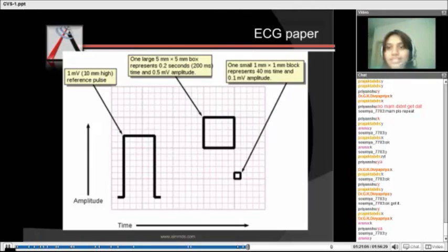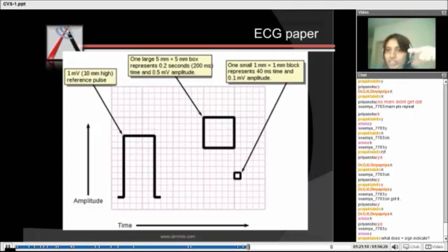Let's go to the ECG paper. What kind of paper is an ECG paper? How does it help us to measure the time interval? Okay, so these impulses, whatever is generated, which creates the wave, are recorded on a paper. It's like, because of the impulses, a pointer moves up and down, because of the electric impulses it is getting.